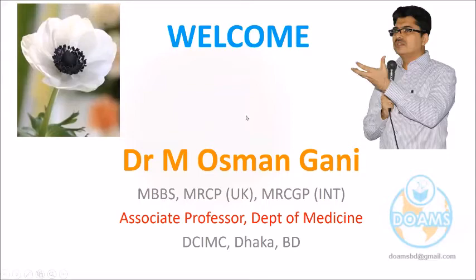Today's class will be a little different, not a specific system, but some technical and very important issues in our day-to-day practice and important for the exam as well. Not only for the AKT, it is important in your OSCE exam also and in future, that is the X-rays. And today we will give you some idea about common ultrasound as well. It will be an extended feature for you, but not in too much detail, just the very common ones. I hope it will also be useful for our practice.